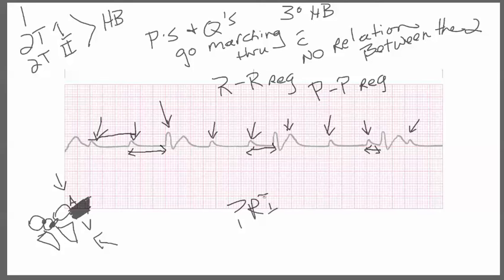But when you look at the PR interval, that PR has absolutely no correlation. Look here and you compare it. Well it's not supposed to get narrower. If it's going to do anything it's going to get wider. So when you're looking at this you're like okay, this is a third-degree heart block.